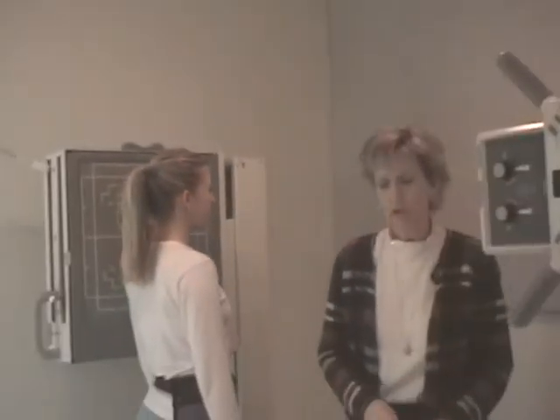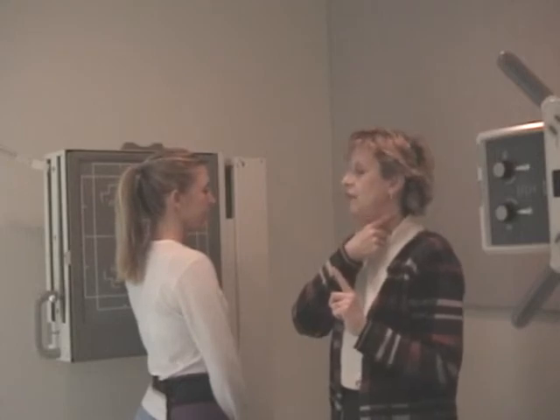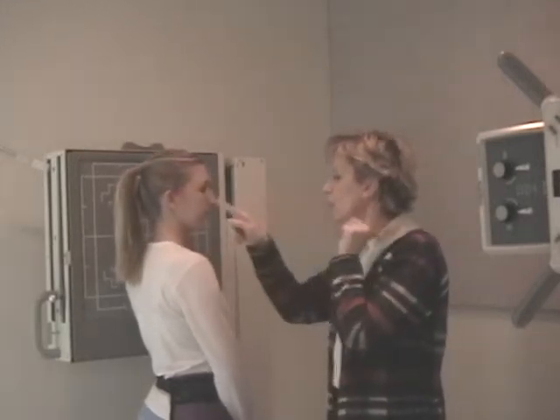If you've done a good job on a lateral cervical spine, you elevate the chin. That will get the rami away from the cervical spine. And if she's in a true lateral position, the rami of the mandible will be superimposed. One won't be forward and one won't be back. And then your zygapophyseal joints will be well demonstrated. And that's the criteria for a lateral C-spine, making sure all C7, 1 through 7 are on there, and inclusive of T1. Let's do a swimmer's next, just in case.